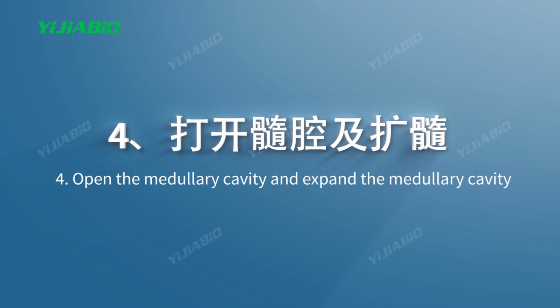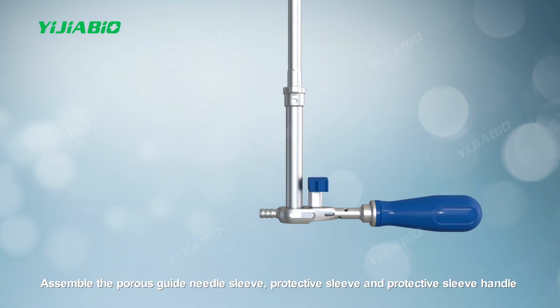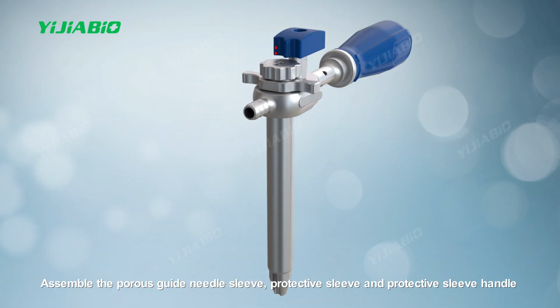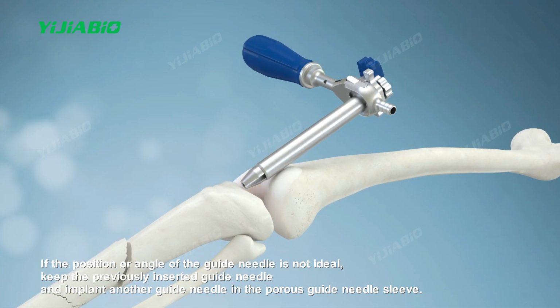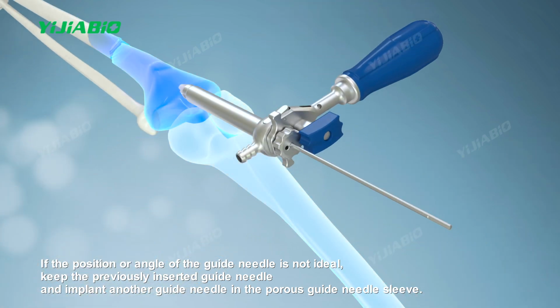Four, open the medullary cavity and expand the medullary cavity. Assemble the porous guide needle sleeve, protective sleeve and protective sleeve handle, and stick them to the bone surface along the incision. Drill a 3.2 threaded guide needle through the porous guide needle sleeve. If the position or angle of the guide needle is not ideal, keep the previously inserted guide needle and implant another guide needle in the porous guide needle sleeve.